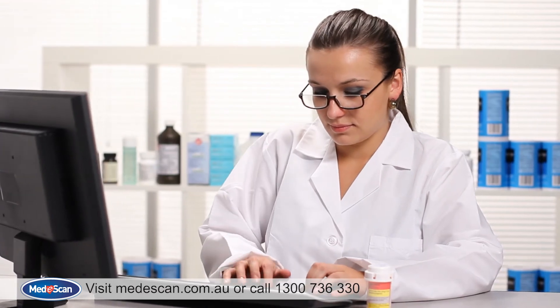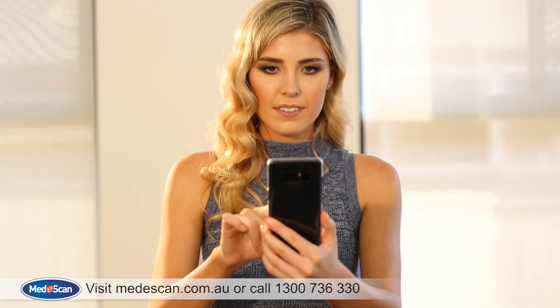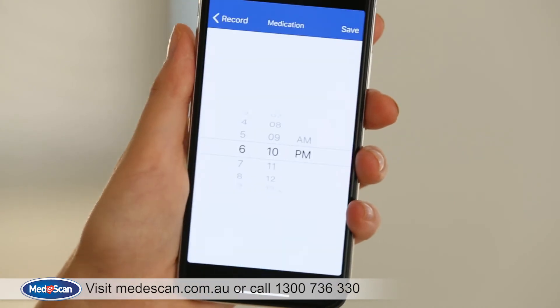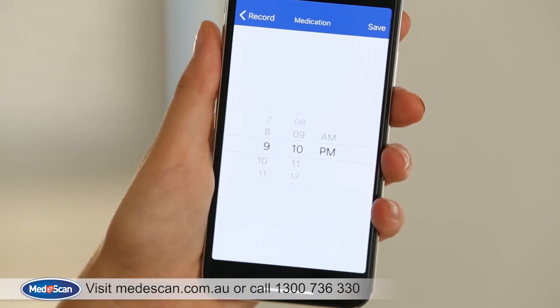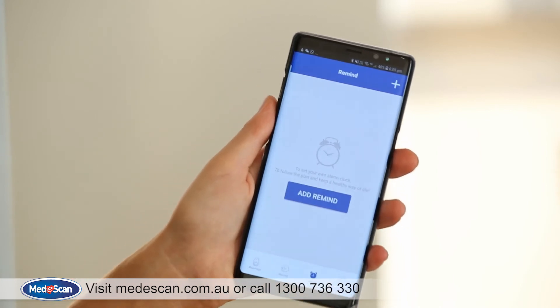The results displayed can be useful for diagnosis and treatment. The app can also record when you've given medication — simply add an event by pressing here. You can also set reminders for medications or doctor's appointments.